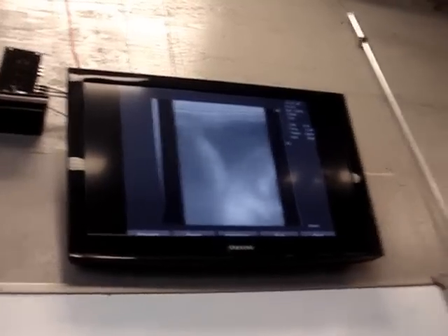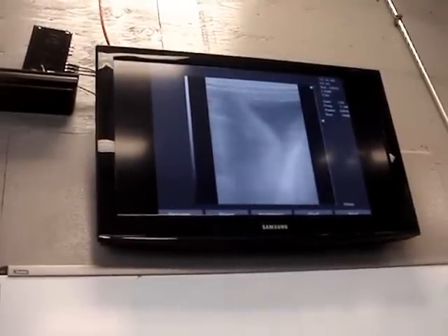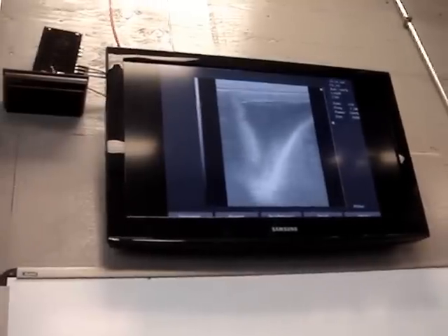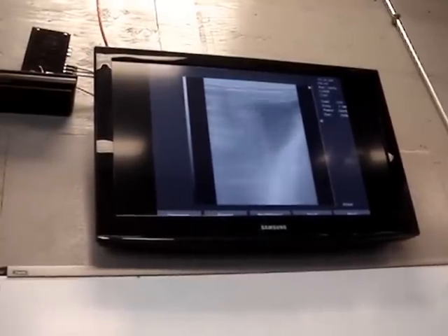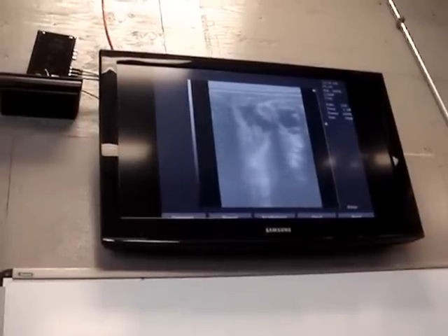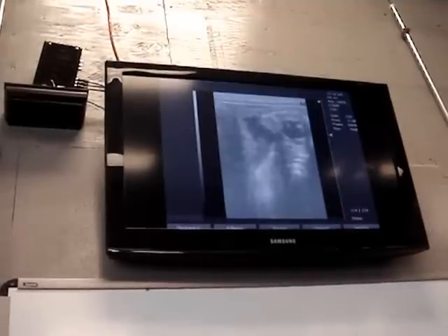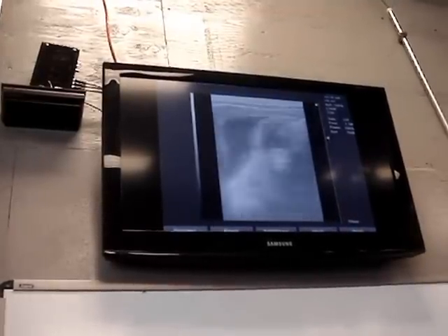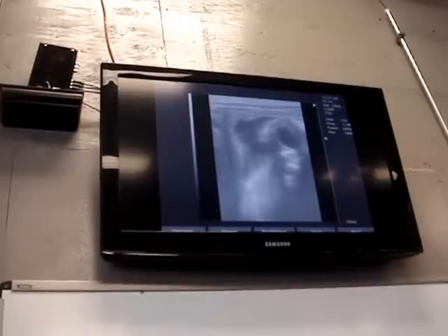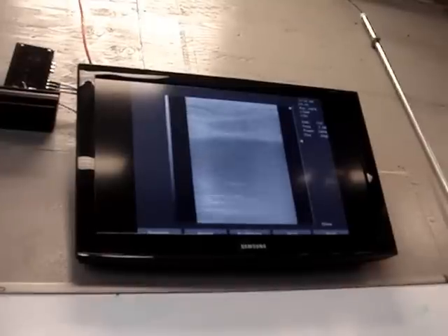Oh, he's moving now. So that's baby right there, that white line. That's him moving, not me. So you can kind of see him bouncing. That's probably his head, which is what was up here before. I'm just pushing him right now. Oh, there he goes. So that's him moving. That's his eye right there. That dark spot? Yep, that circle, like I said, fluid is black, so that's actually baby's eye. And so he's looking up at me saying, why are you pushing on my nose? So we'll stop torturing mom here.